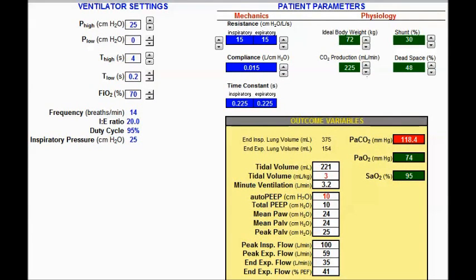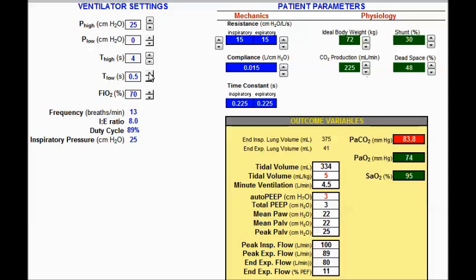The second technique to set t-low is titrating t-low to target a tidal volume of 4 to 6 cc/kg of ideal body weight. P-high and p-low remain constant; t-high remains constant. I will titrate t-low to get tidal volume in the 4 to 6 cc range. We're currently at 3 cc/kg with compliance of 15 and t-low at 0.2. Increasing t-low incrementally through the common 0.2 to 0.8 range while monitoring auto-PEEP and tidal volume.